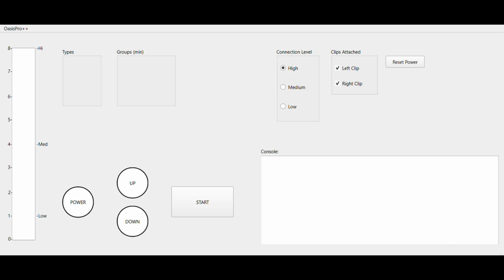So on the right side, you have an admin panel. This is to simulate various events while you're doing the electric therapy. So say if you were doing the therapy and you're 10 seconds in and all of a sudden the connection level drops to low, what would happen in that situation? The software is supposed to handle that.